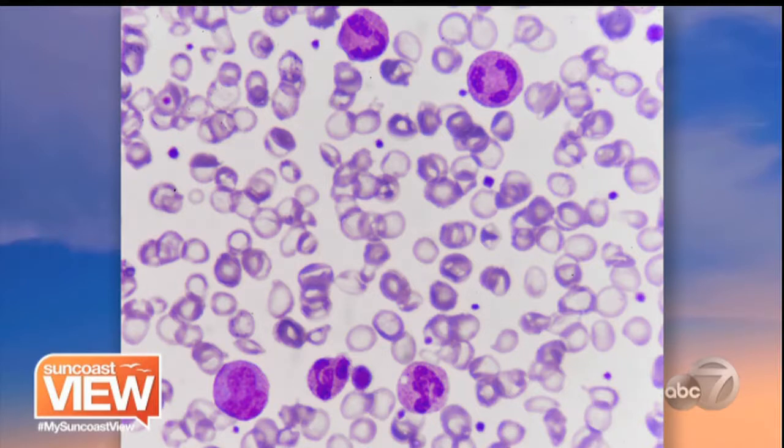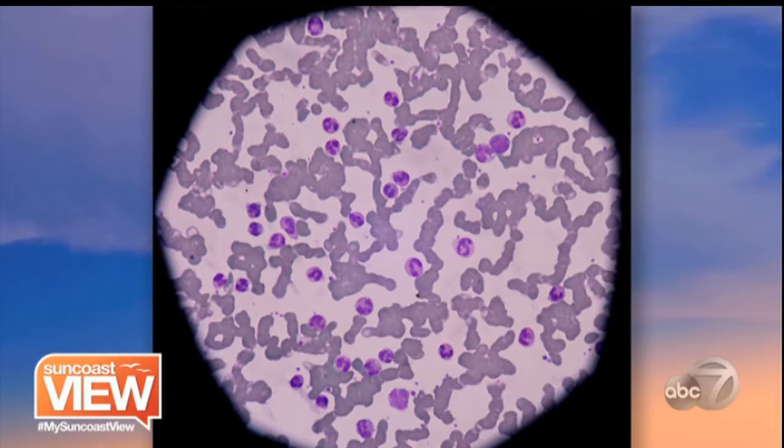So a patient that comes in saying, you know what, I have low energy, I can't sleep, my bones ache, and I'm like, well, you're anemic. The moment I look at their cells, you can tell. And then those bigger circles, those are the white blood cells. White blood cells are so important to protect the body from different types of funguses and diseases.